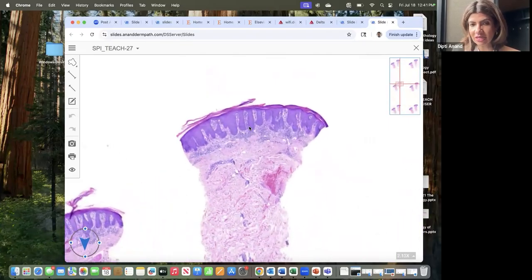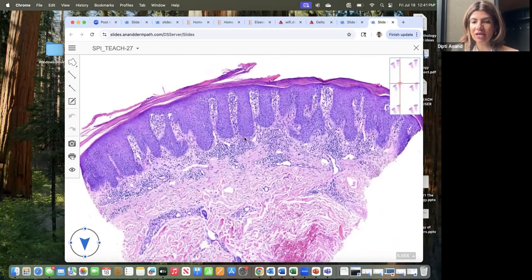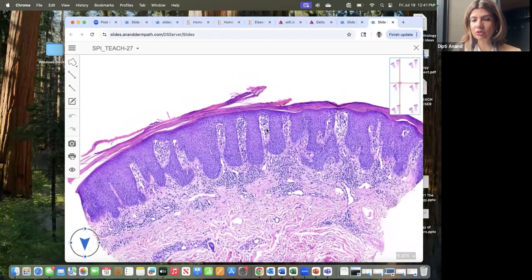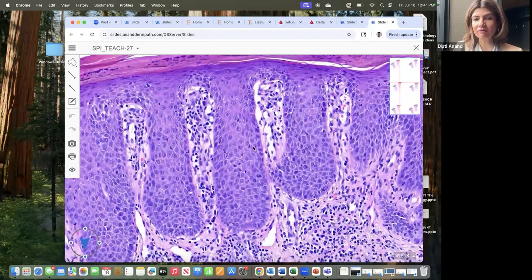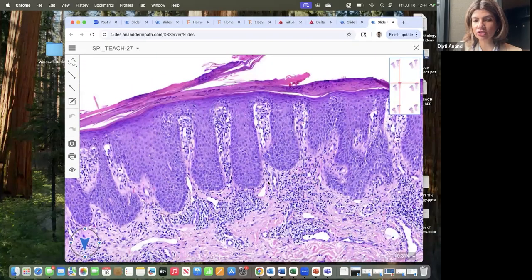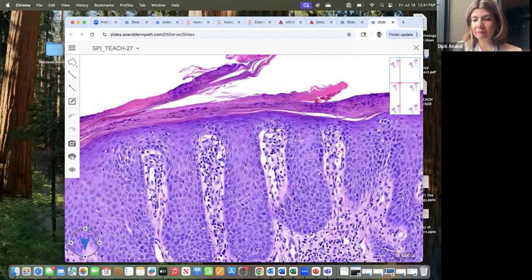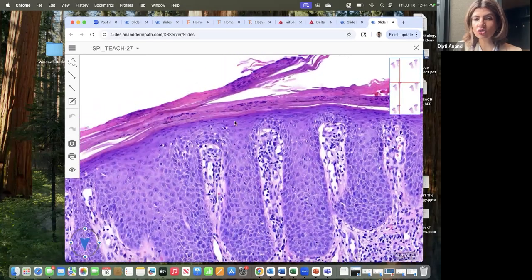So we talked about this last week as well. What makes something psoriasiform is a pattern of the epidermal thickening. So psoriasiform epidermal hyperplasia has bulbous rete ridges, these feet which are bulbous and swollen, with suprapapillary epidermal thinning and these dilated vessels present right beneath it. So you have psoriasiform epidermal hyperplasia with bulbous swollen rete ridges, suprapapillary epidermal thinning, dilated vessels, loss of granular cell layer.